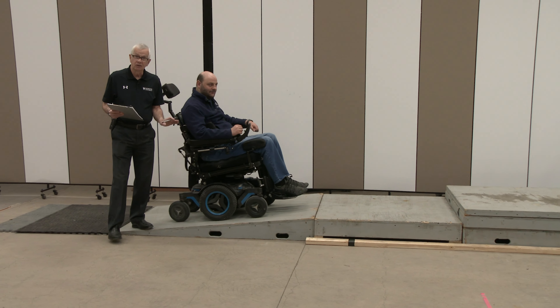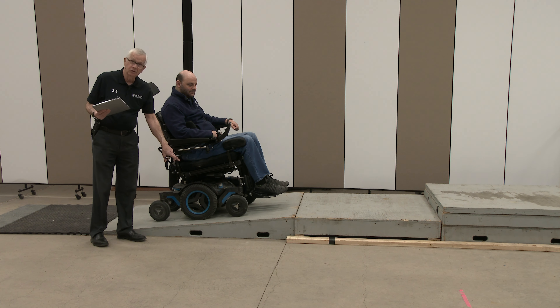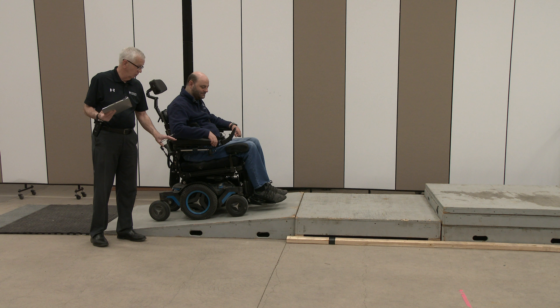On an incline, depending upon how steep it is, the weight shifts back onto the rear wheels, and so the drive wheels may have more difficulty with traction. If that's the case, you're going to want to have the chair tilted as far forward as possible to keep the weight on the uphill wheels.